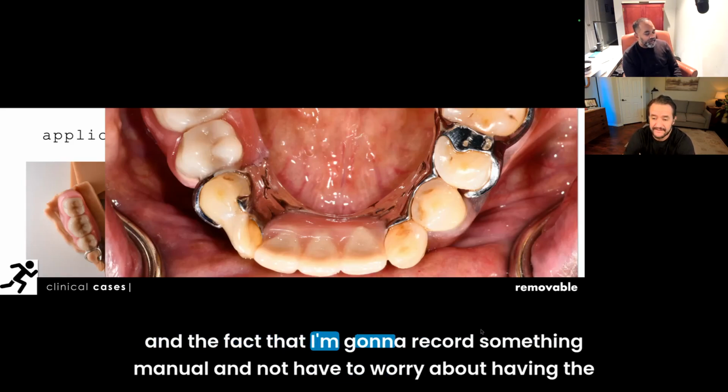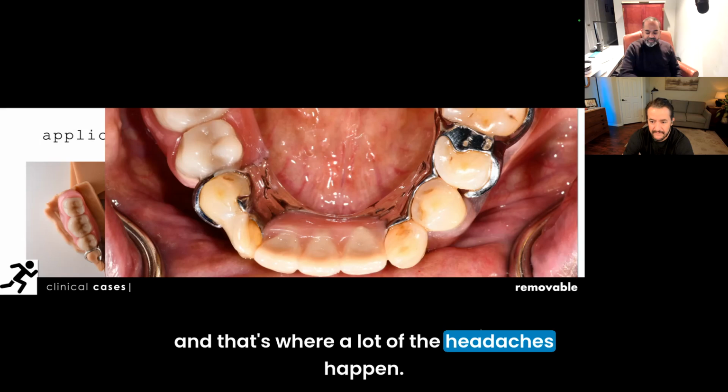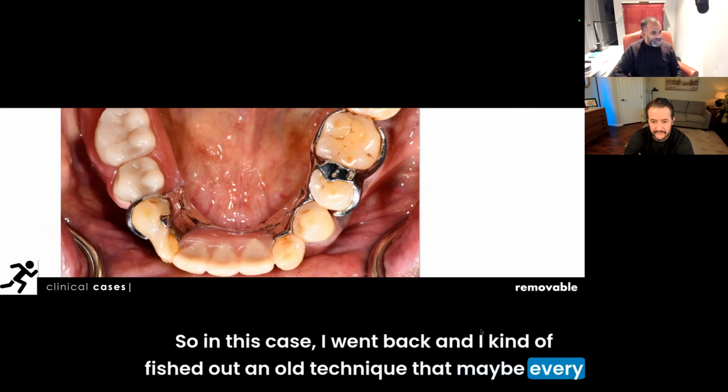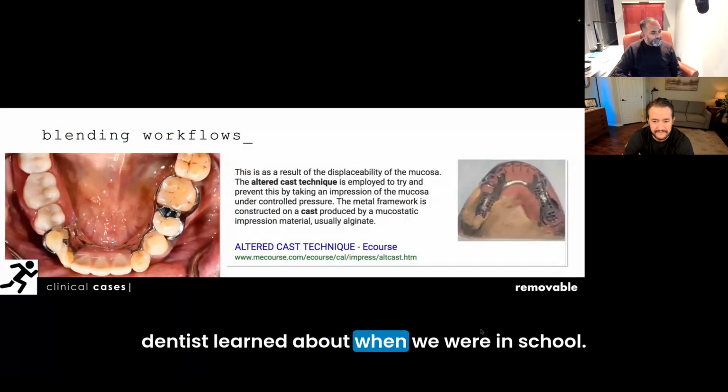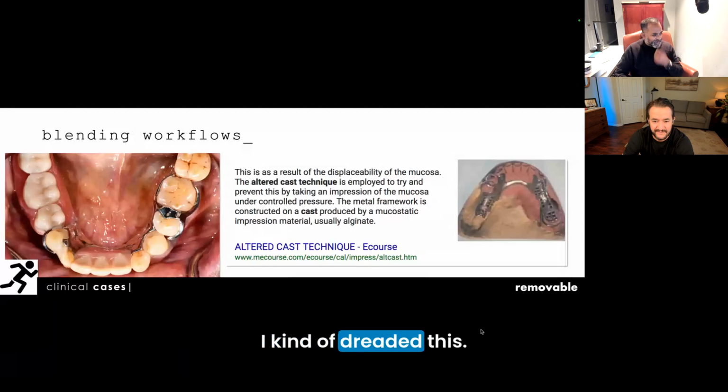And the fact that I'm going to record something manual and not have to worry about the impression material going all the way to the other side and getting caught in the undercuts, and that's where a lot of the headaches happen. So in this case, I went back and fished out an old technique that maybe every dentist learned about in school. It was not the most fun thing to do in school. I kind of dreaded this.